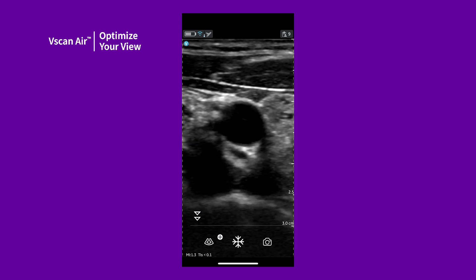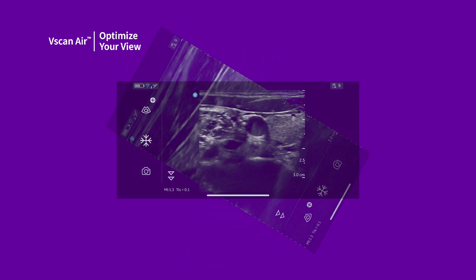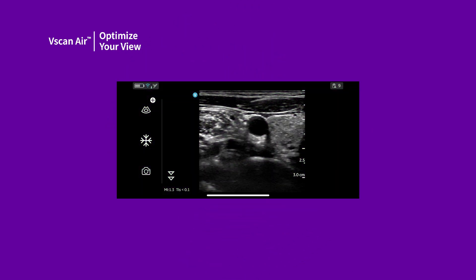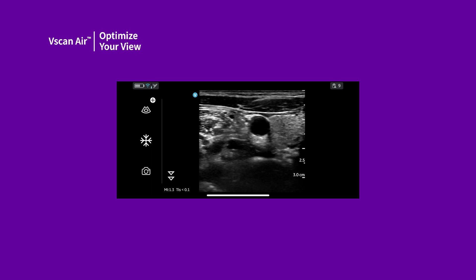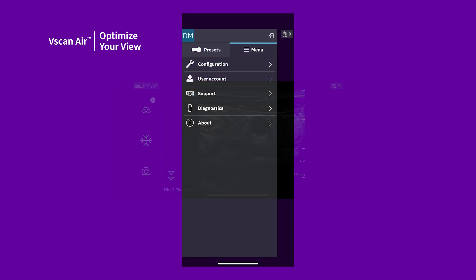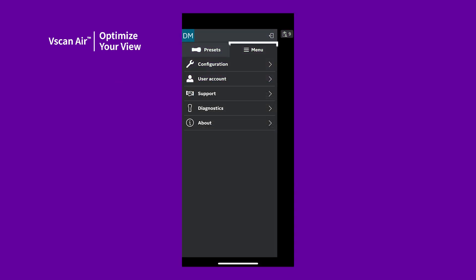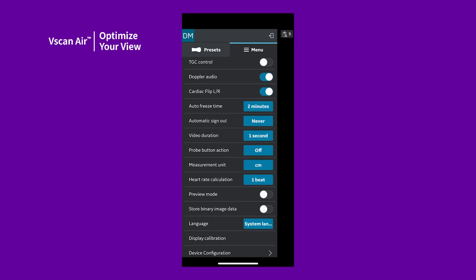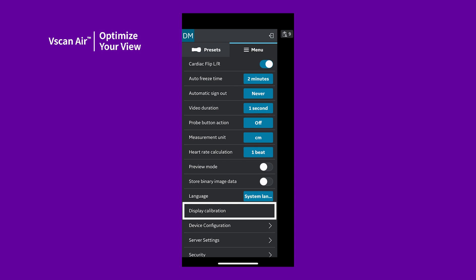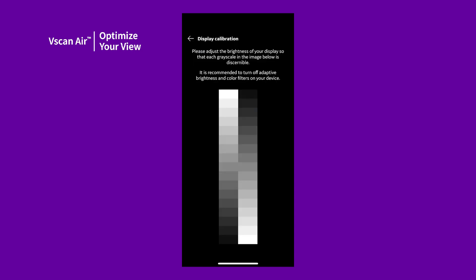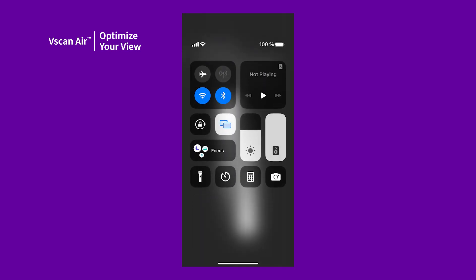To see the entire image, rotate the device to landscape. For optimal image visualization, it is important to adjust the brightness of your device for displaying the complete range of grayscale. The image under display calibration can be used to adjust the brightness so that the darkest shade disappears into the black background and the brightest shade appears bright but not saturated.